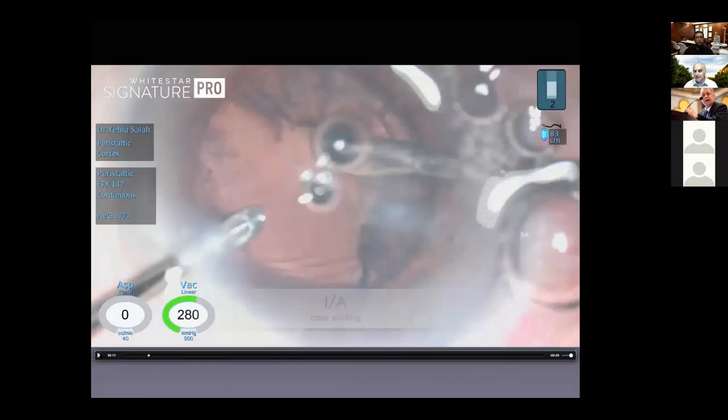One of the rules in posterior capsule rupture is, first, always try to see well with good magnification so you can see the complication happening, so you can prevent further complication. And if the complication happens and you see it, you can manage it in a much better way than if you wait for the complication to increase and manifest to you with secondary signs. You don't have to wait for this. So the key is to identify that there is a problem.